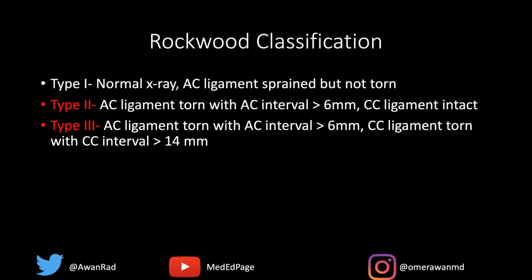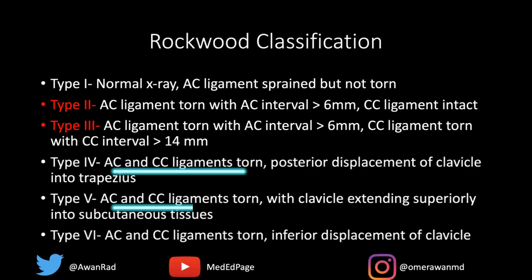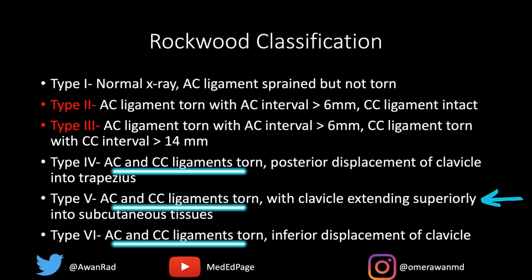Types 4, 5, and 6 are very rare — about 90% of cases we call are going to be type 2 and type 3. In types 4, 5, and 6, the AC and coracoclavicular ligaments are all torn. In a type 4, the clavicle goes posteriorly — it displaces posteriorly to the trapezius. A type 5 is like an exaggerated type 3, where the clavicle extends superiorly all the way to the subcutaneous tissues, almost coming to the skin surface. A type 6 is when, instead of superior displacement of the clavicle, there's inferior displacement of the clavicle, which can impinge on important structures. That's rare.